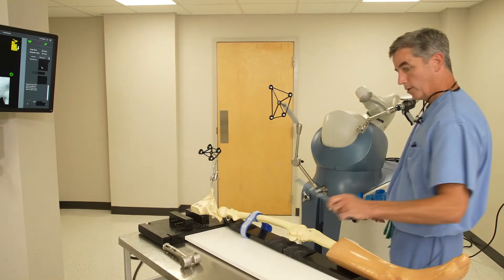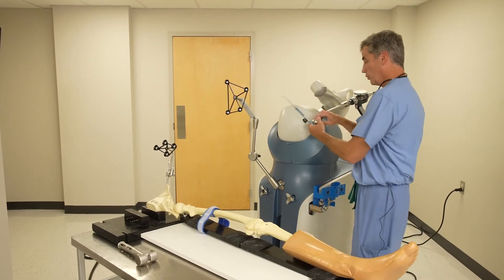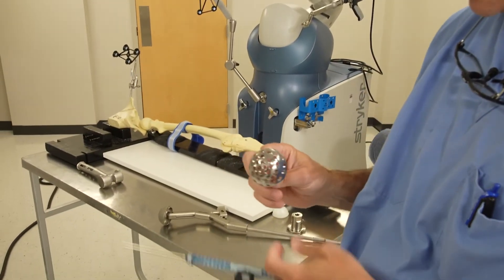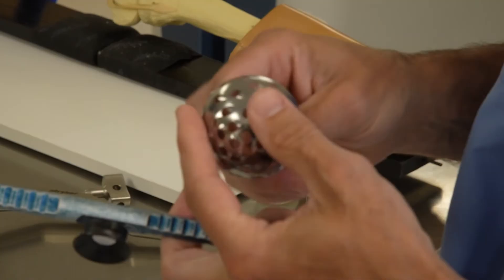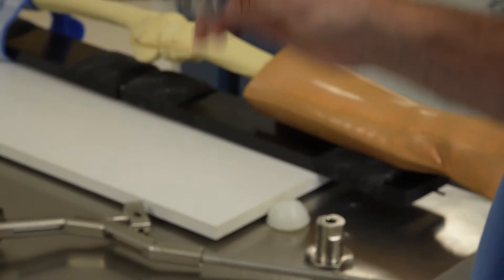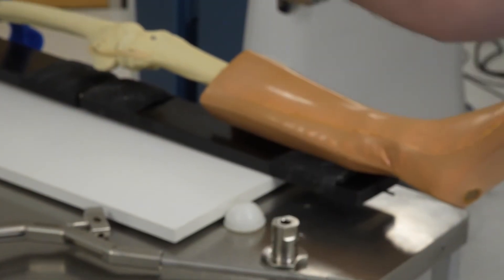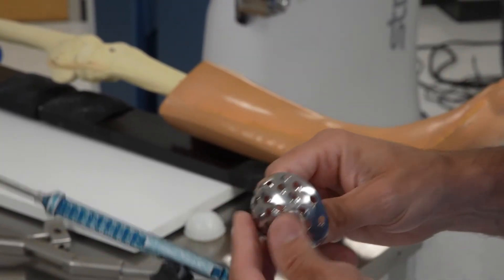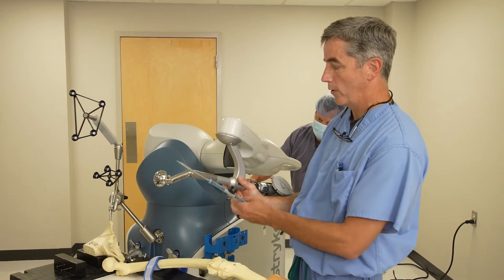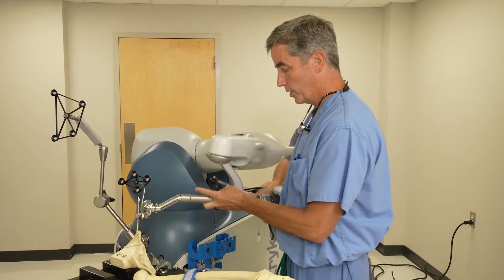Now we bring in the robot. Basically, this is what we use — my best analogy is kind of like a shaped cheese grater. It's what we use to shape the bone inside there to fit the cup. It's attached to that arm and spins just like a drill. This is going to tell us how far and what angle, that sort of thing. We call it a robot, but I still run the robot — I'm still very involved in the procedure. It's not like I sit back and let it do its thing.